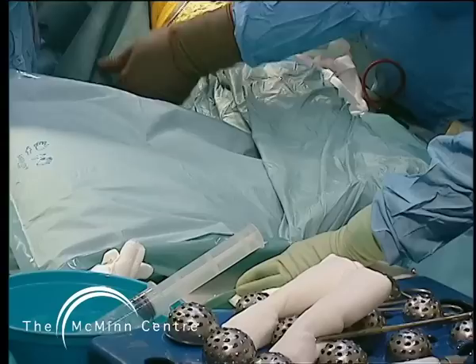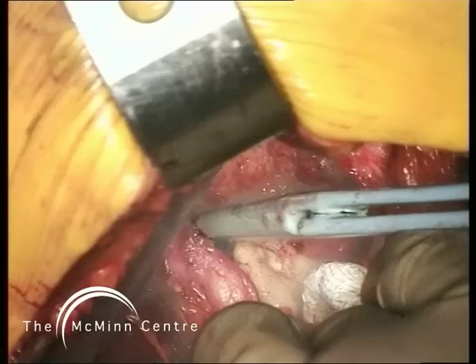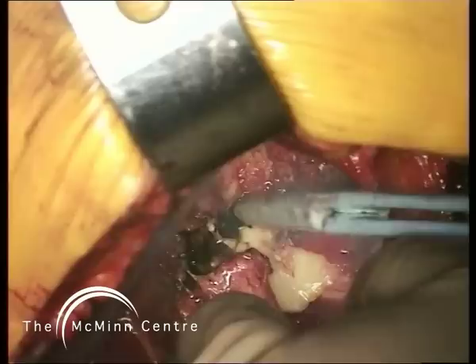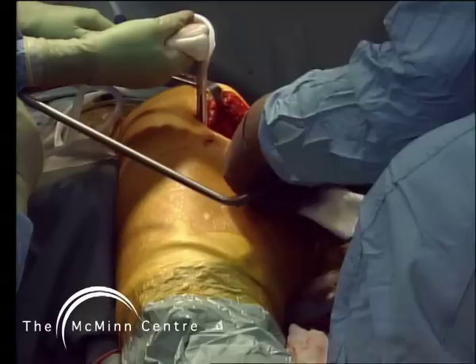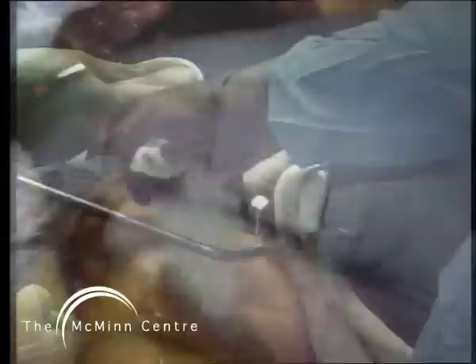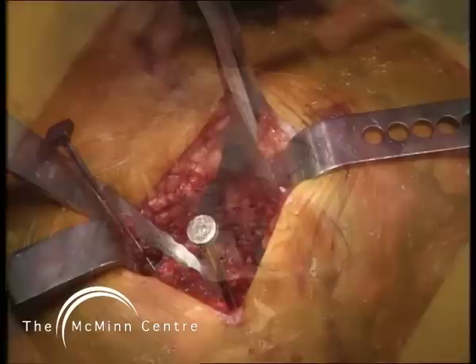The hip is flexed and I'm using a sterile pillow on the nurse's tray to stop the leg falling off the front edge of the table. The second capsular cut is anteroinferior, because when the femoral head is displaced up and forwards this makes the anterior capsule tight, so we cut the anteroinferior capsule over the position of the psoas. A retractor is then inserted under the transverse acetabular ligament and the teardrop, hooked onto the Charnley frame. A small retractor is placed over the front of the acetabulum close to bone, and a second pin retractor in the posterior column. We now have all the retraction required for the acetabular part of this procedure.